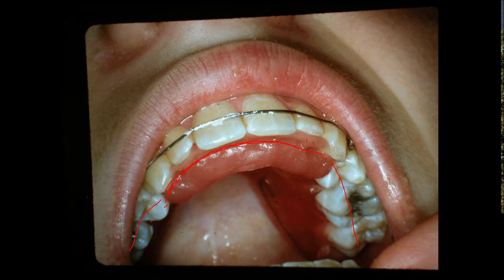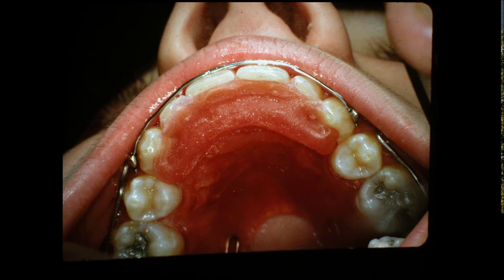Now we'll have a track in here — all these teeth were in contact and your front teeth are contacting up here. If you do this on a deep bite case, you let the case go until you've got proper overjet and overbite, and then you make this. If they stay with that retainer, that bite relation will stay like that from then on. If they leave it out for a day or two, the lower teeth might over-erupt a little, but if they put it back in and wear it consistently, they will go back down and these teeth will come back in contact. If you leave it out and your lower teeth over-erupt, then these teeth won't come in contact properly. So if you've got a TMJ problem, you don't want to do this because you're putting the weight right here on the jaw and then it's back on the condyles — and while you take these out of occlusion, in just a short time they come back into occlusion. There's a lot to retention that most people don't know about or pay attention to, and that's why we've got a lot of TMJ problems too.